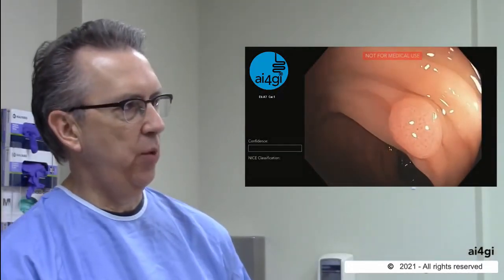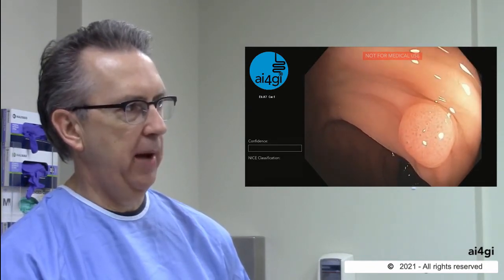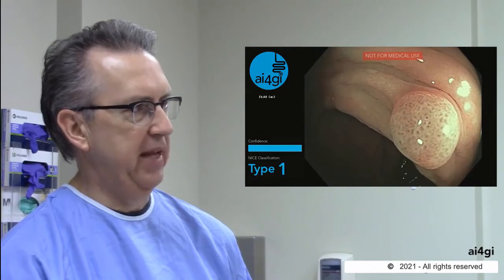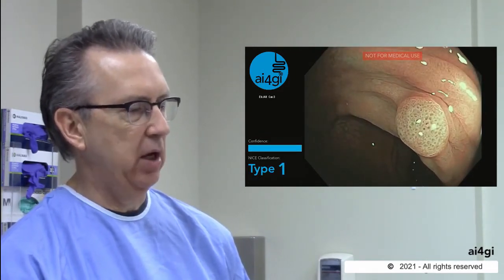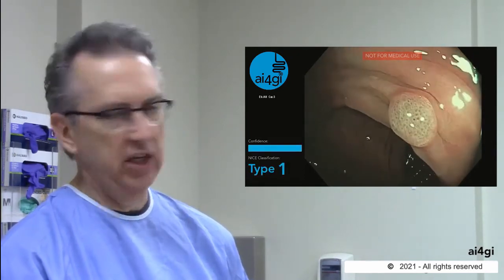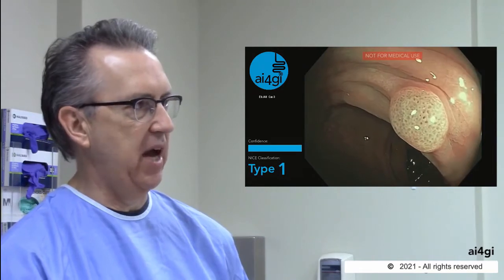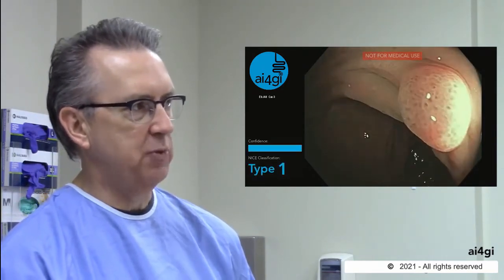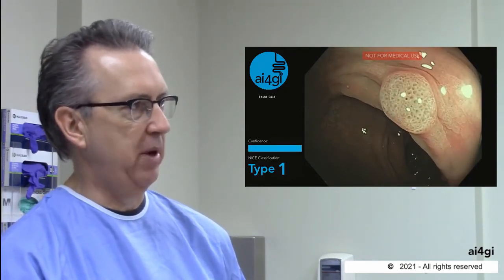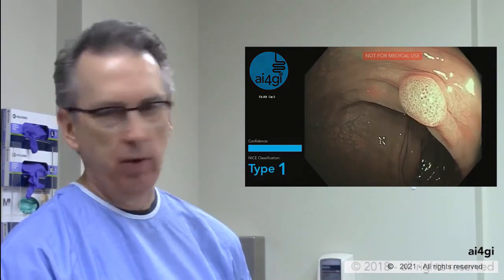Here's an interesting lesion in the rectum. Even in white light, this appears to be type 1 — you can see the dark pits. I don't see any blood vessels on the surface of this. It also has large open pits, which I think is the most common endoscopic feature we see for sessile serrated polyps in lesions that are diminutive. The other WASP features are not commonly seen. You can see the program is developing high-confidence type 1. Despite the dark structures, it's able to analyze this surface structure and determine that this is a high-confidence type 1 lesion. It's in the rectum, but because of those large open pits, I would still remove this lesion.